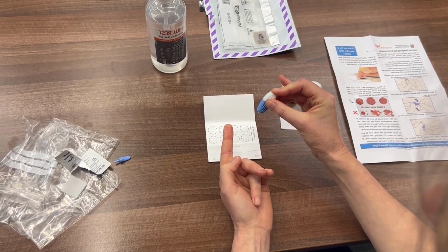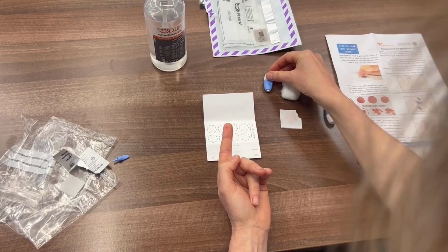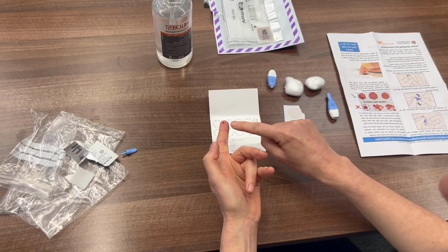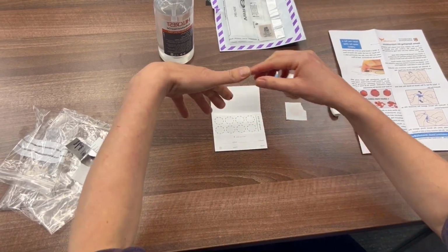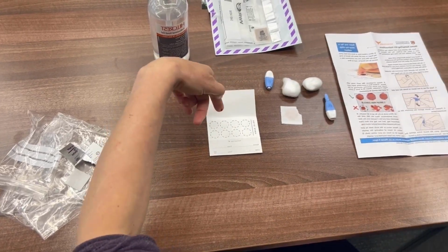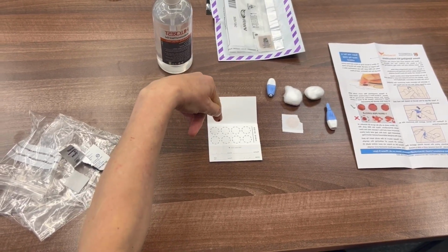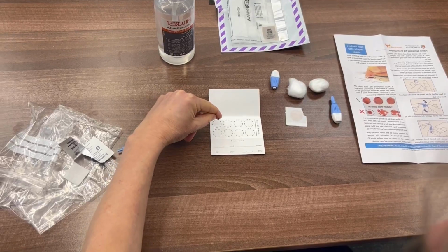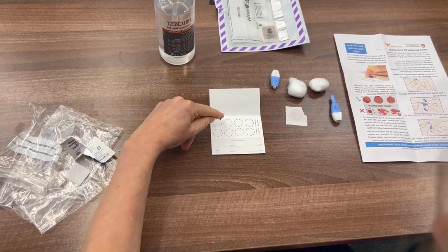You can see I've got a very small drop of blood there. I'm just going to put the lancet down. Now, it sometimes just takes a little bit of time for that blood to start flowing, okay? So I can massage it down a little bit to try and get the blood towards the spot, but the flow will increase as we go.